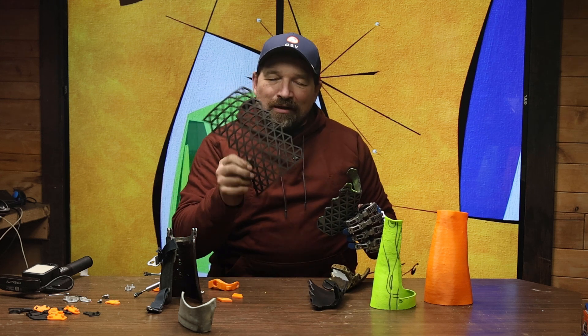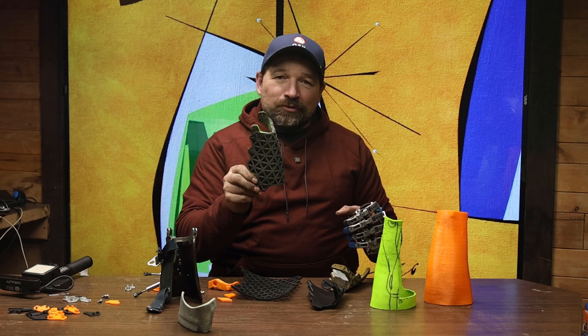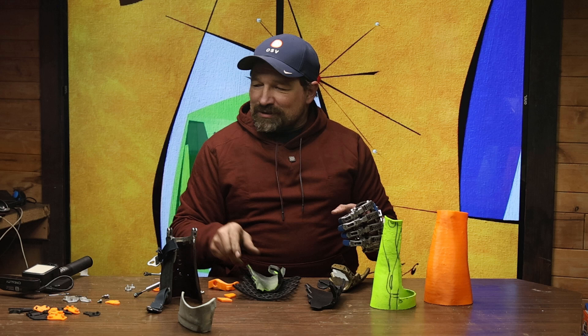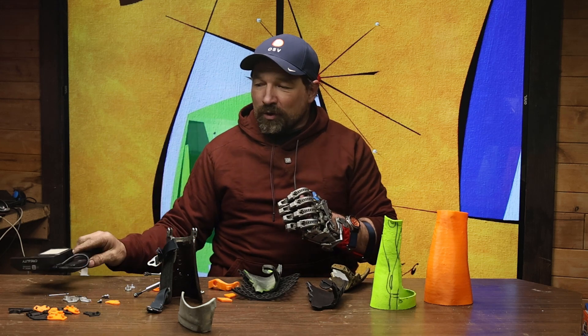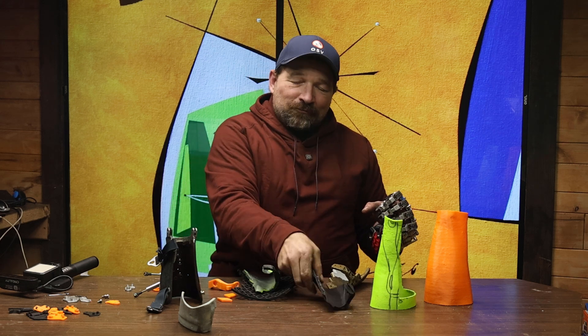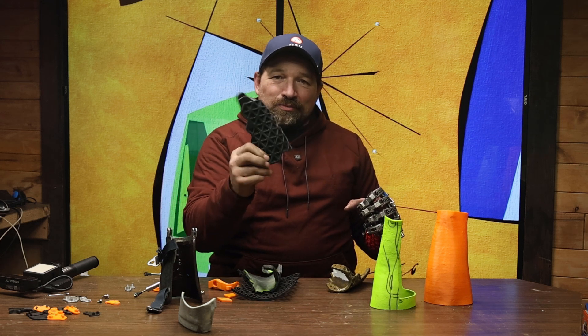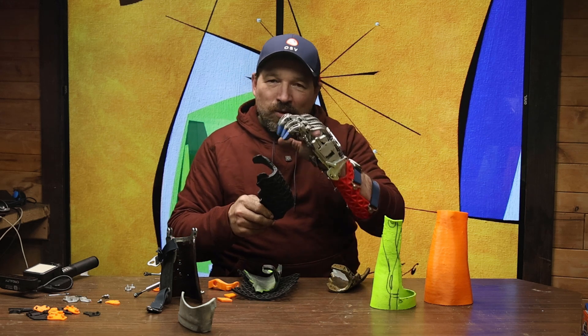Rather than drawing the ISO grid digitally, what I did is cut it out of EVA foam and then super glued it to the ABS, then used my scanner to scan it into the digital world, do a little bit of refinement, and clean it up.